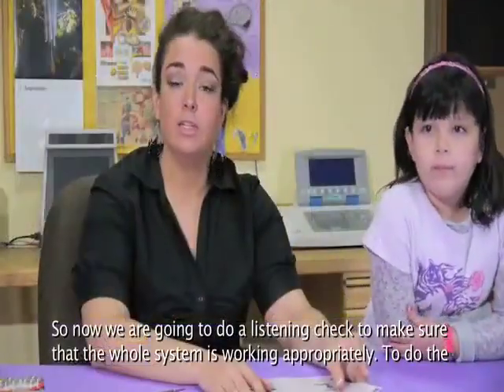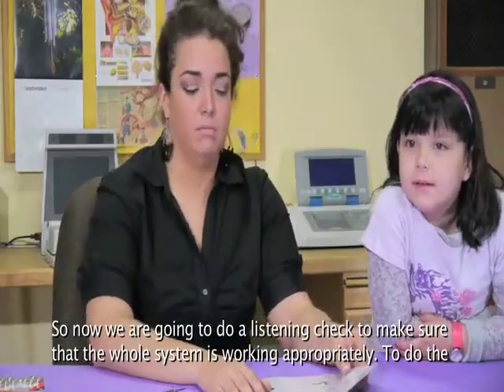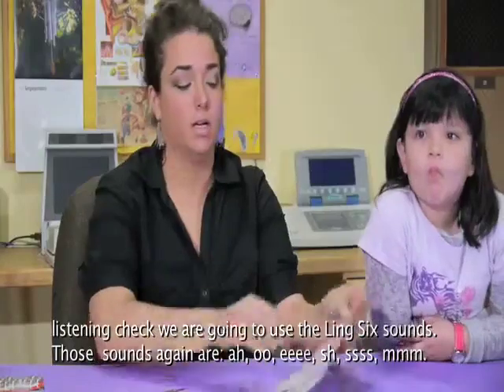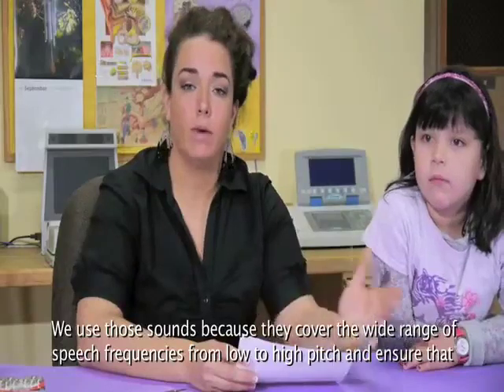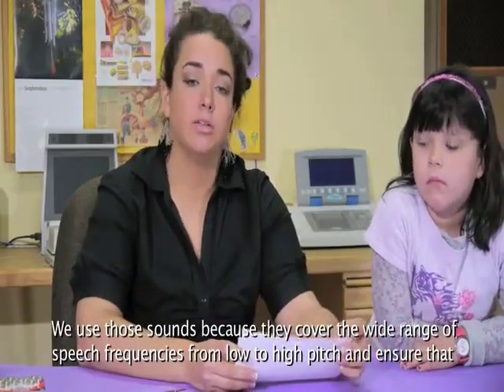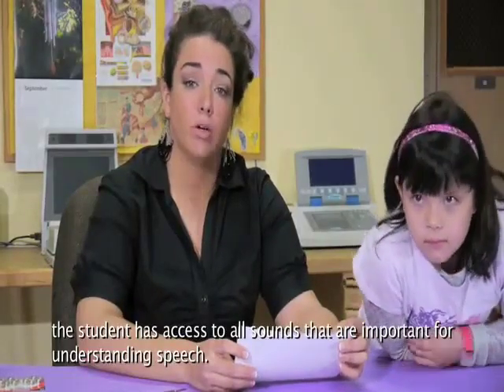Now we're going to do a listening check to make sure the whole system is working appropriately. To do the listening check, we're going to use the Ling 6 sounds: ah, oo, ee, sh, s, and m. We use those sounds because they cover the wide range of speech frequencies from low to high pitch, and ensure that the student has access to all sounds that are important for understanding speech.